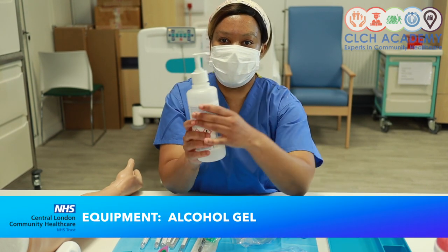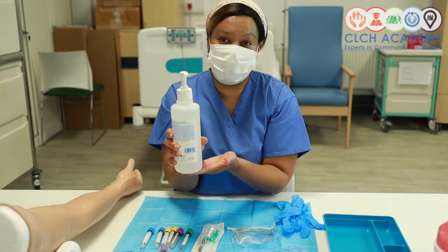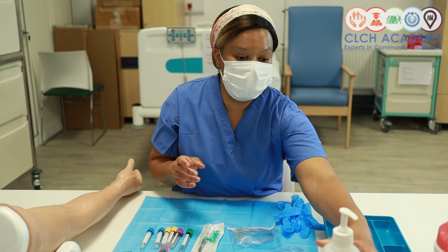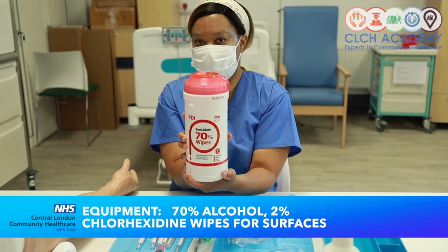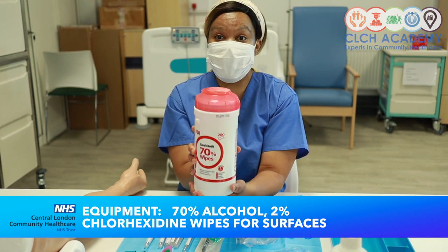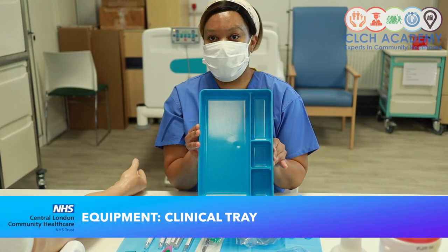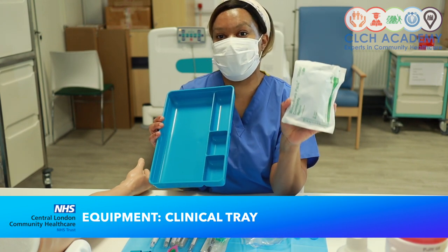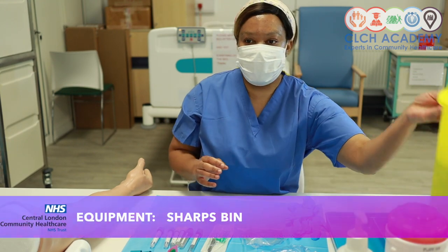You also need some alcohol gel, and this is to sanitize your hands. I've already washed my hands with soap and water, but in the interim, I will be using the alcohol gel if you cannot get access to running water. And I've got the red top Sani-Cloth to decontaminate my equipment if you're thinking more of a clinic setting or an inpatient bedded area setting. A tray would be more appropriate for an inpatient bedded setting if the community dressing pack is not what you need for your setting. And last but not least, a sharps bin.